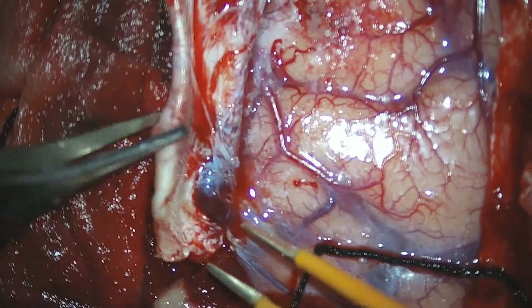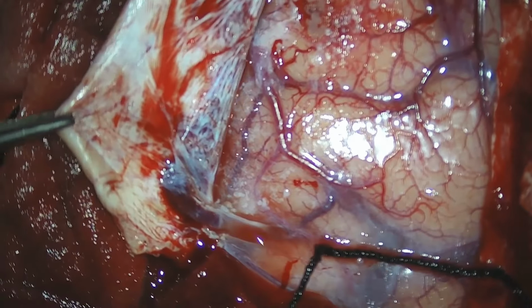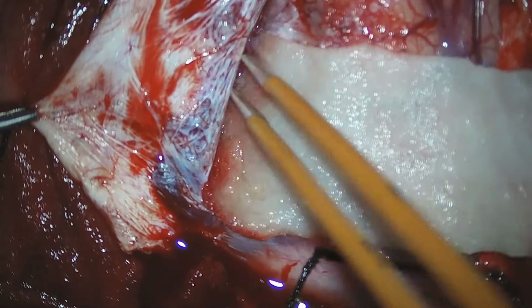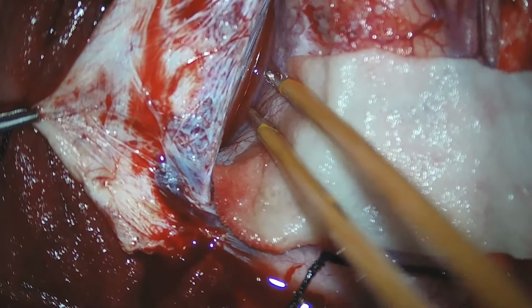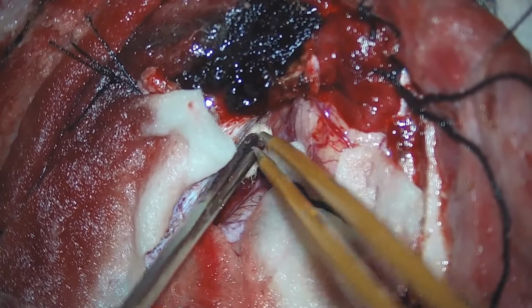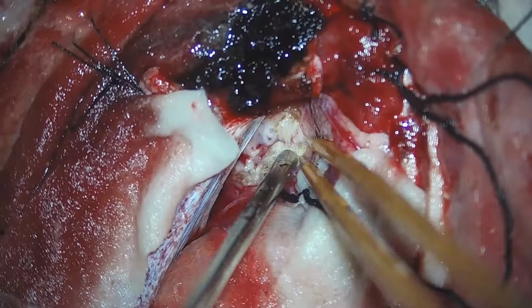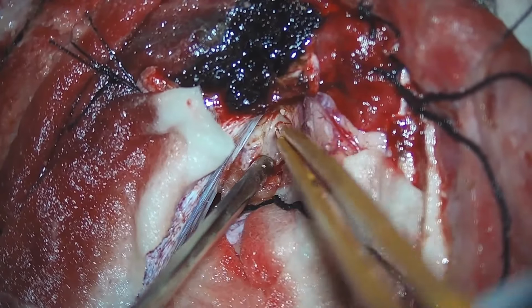Here we can see one draining vein into the superior sagittal sinus, which is carefully left intact, and any adhesions surrounding the vein are separated. A cotton pledget is always used on the brain surface to minimize any traction injuries. After dynamic retraction, we can see the surface of the glioma over the interhemispheric area, and we carefully open into the tumor.